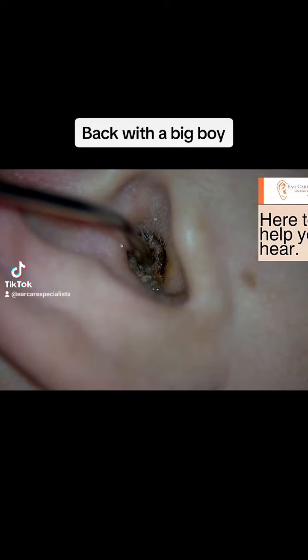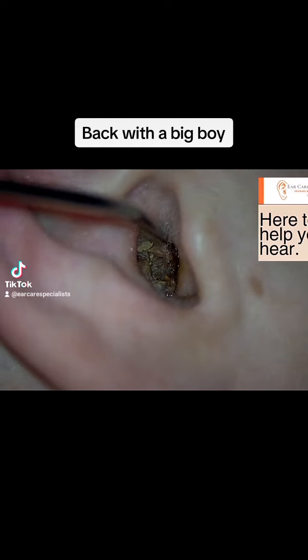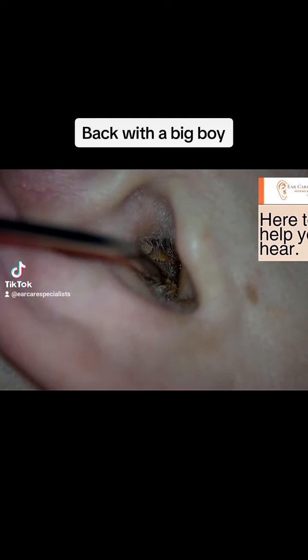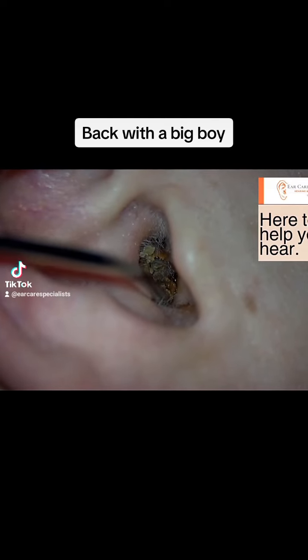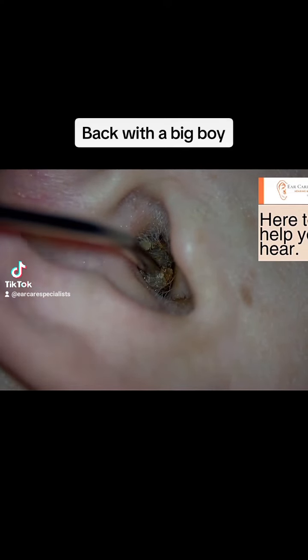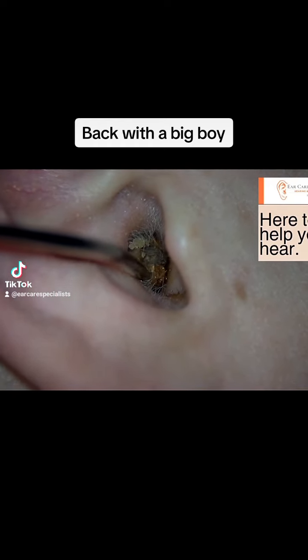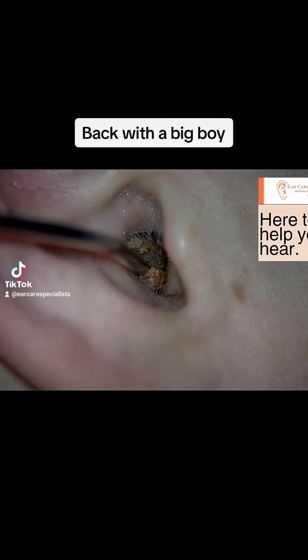So you'll see me just slowly working the wax, trying to just wiggle it and get it to a point where it's ready to come out. Here we can see it, so I've removed the speculum, just pulling the ear up and back to give myself a bit more room, straighten up the ear canal, and then we'll start to get it out. You can see here, look, just how blocked and packed in it is in their ear.